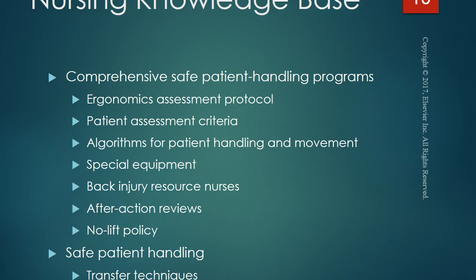Nurses often provide care for immobilized patients whose position must be changed, who must be moved up in bed, or who must be transferred from a bed to a chair or from a bed to a stretcher. Assess every situation that involves patient handling and movement to minimize risk of injury. After completing the assessment, nurses use an algorithm to guide decisions about safe patient handling. Use the patient's strength when lifting, transferring, or moving whenever possible. Assume an active role in your workplace to ensure that a culture of safety exists and that appropriate patient handling techniques and equipment are readily available.